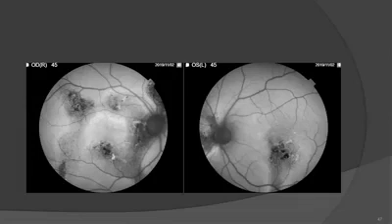Any question from the audience regarding anything that is not clear regarding the imaging modality? I am happy to answer. One question from Dr. Galaxy. Yeah, doctor? Assalamu alaikum. My question is where to aim the micropulse laser and what are the parameters?